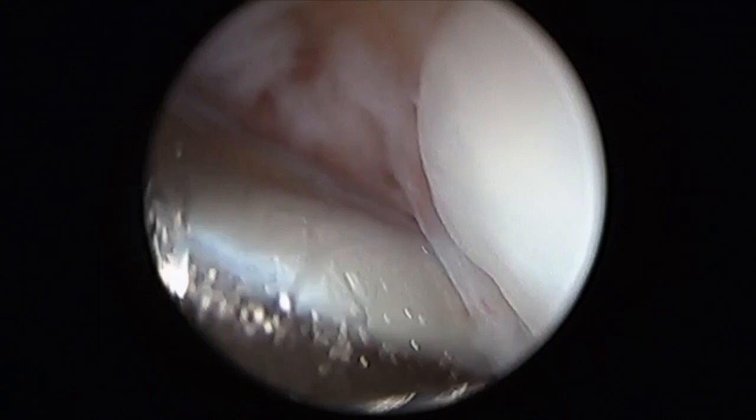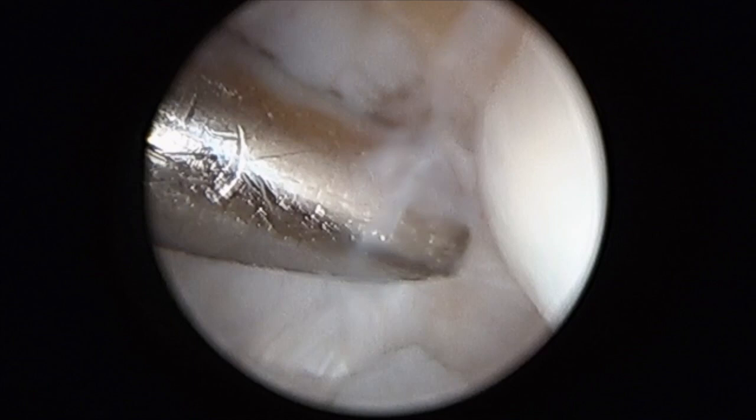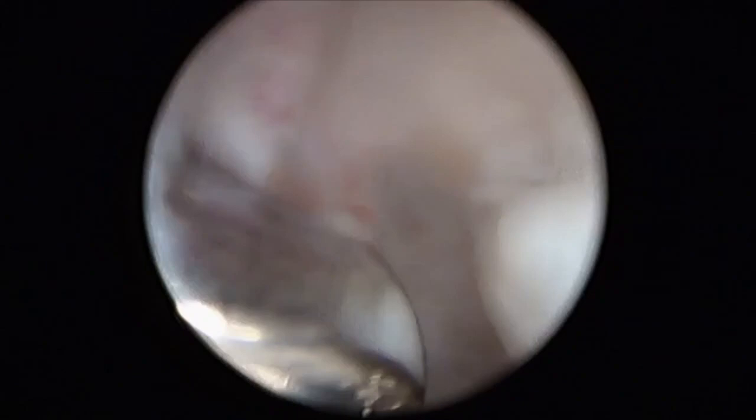In practice, we start with 1-U portal, and then the 1-R portal is identified by transillumination and can be used as an instrumental portal. The first phase of the arthroscopic procedure consists of a complete synovectomy with a shaver, reversing the shaver and scope position to perform the most complete synovectomy.